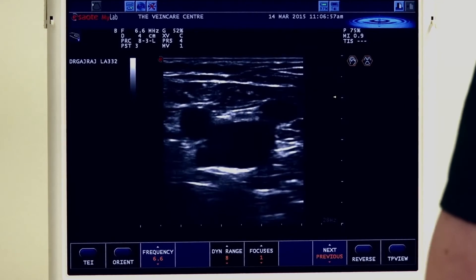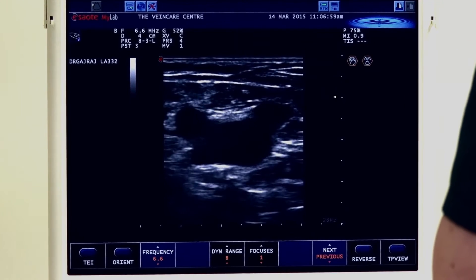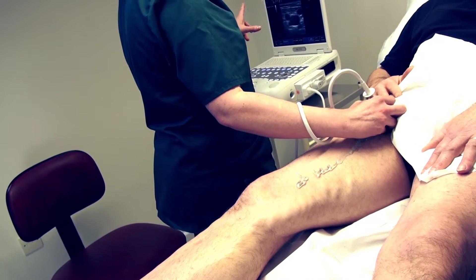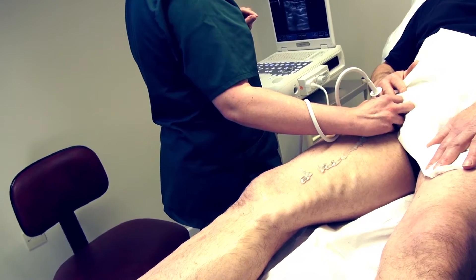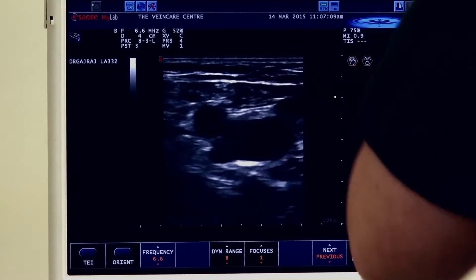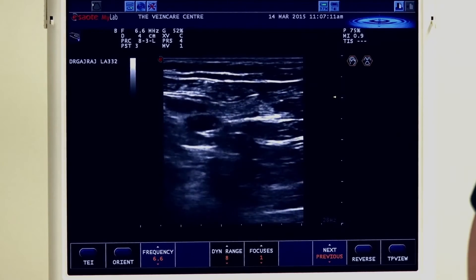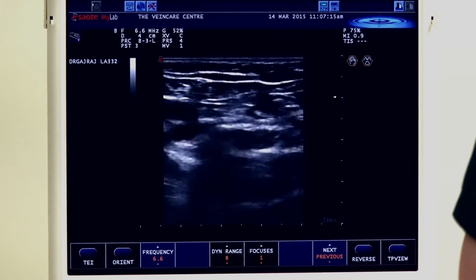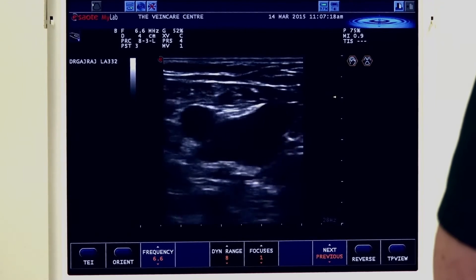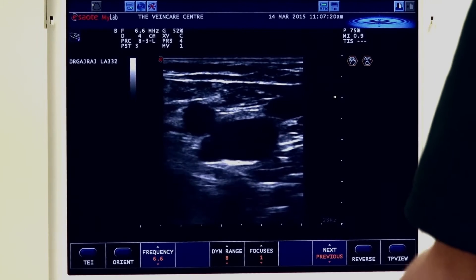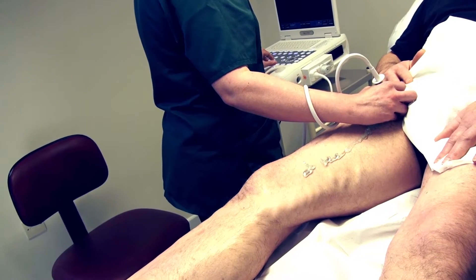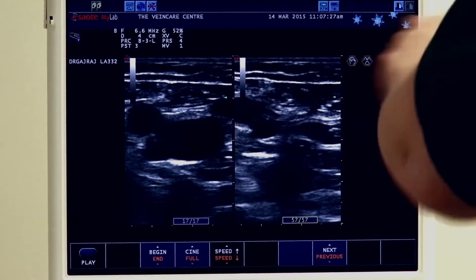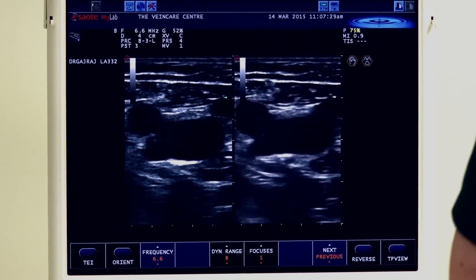We have identified our Mickey Mouse sign again. With a light bit of compression, we push down, and we can see the vein compressing completely. The small vessel adjacent is the artery, which doesn't compress completely because of the elasticity of the walls. We can also see nice compression of the long saphenous vein at the top. To demonstrate this, we can divide our screen into two — one image with compression and the other showing a nice dilated common femoral vein.